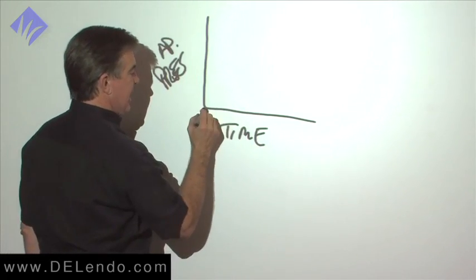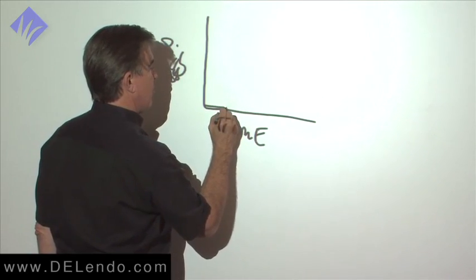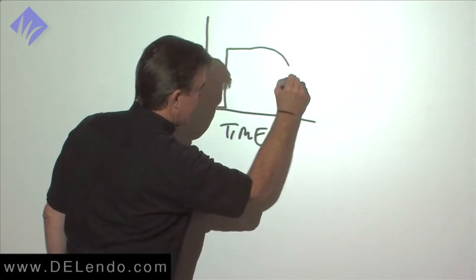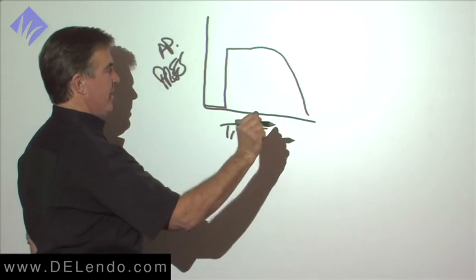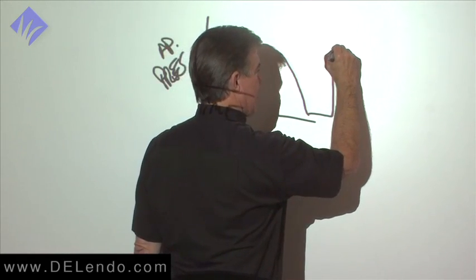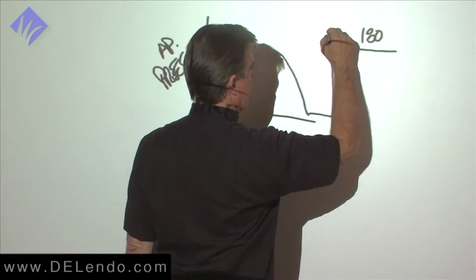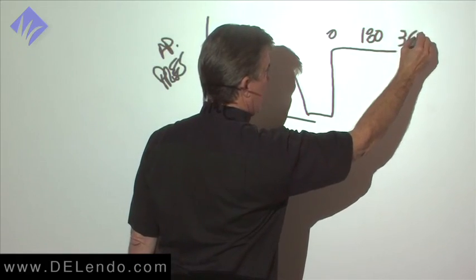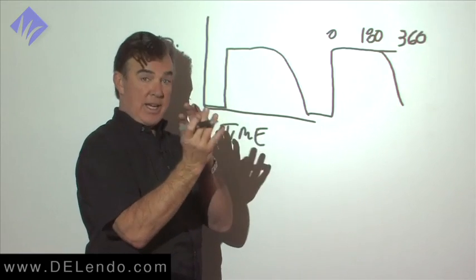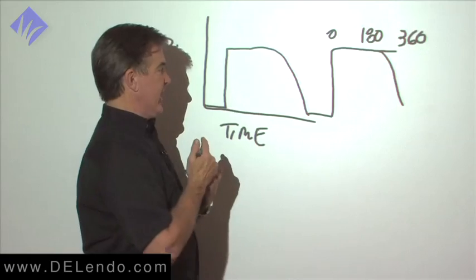Okay, so here's the engagement stroke. No apical pressure. Now we go to the cutting stroke and we put all this force in the file and we rotate, rotate, rotate, rotate, and it gives. And the pressure goes away because it's cut. And then we set the blade again. We put apical pressure on it, and we rotate, rotate, rotate, and between 180 and 360, somewhere in there, it's going to give as those blades pop to the next groove, cutting half of the land between the grooves, and then the next click is when you cut the last part of the dentin.